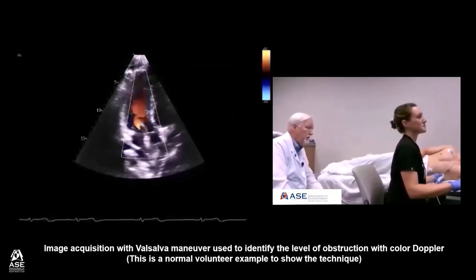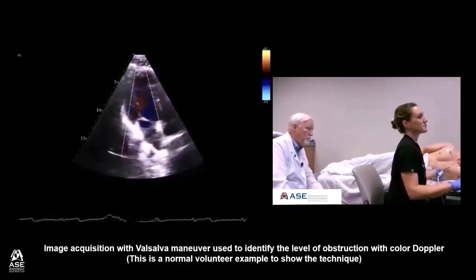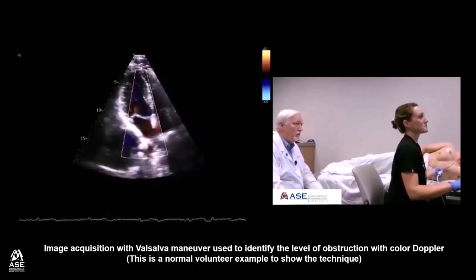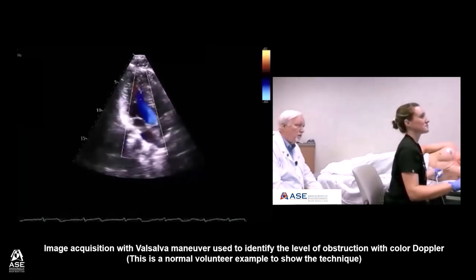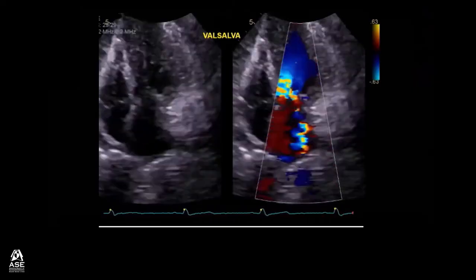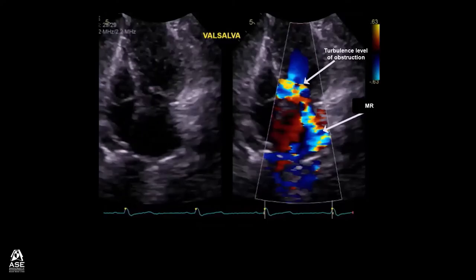Please go ahead and start your Valsalva Maneuver. 1, 2, 3, 4, 5, 6, 7, 8, 9, 10 — release. This long video clip will demonstrate how performing the Valsalva Maneuver while imaging with color Doppler can demonstrate the level of obstruction where we see turbulent flow and show worsening MR.